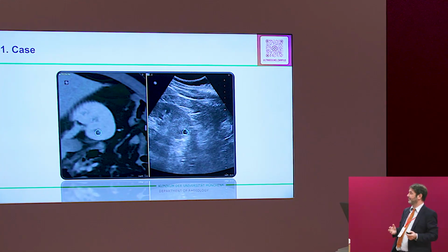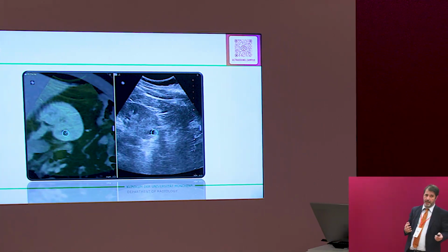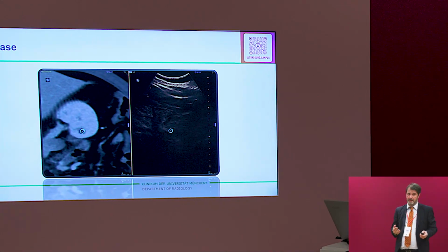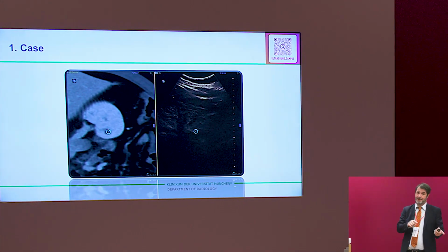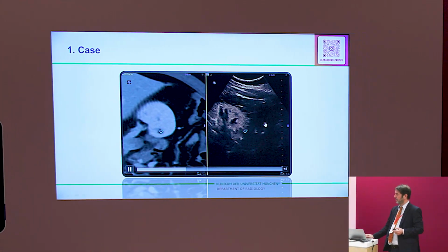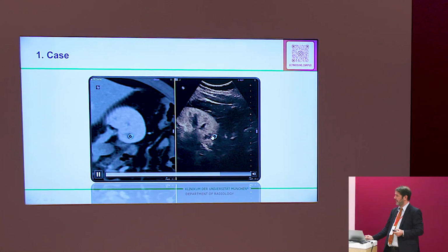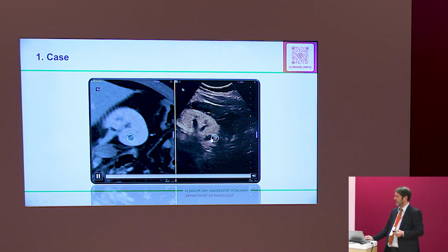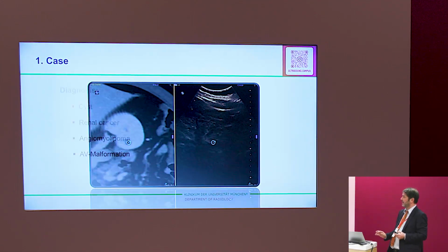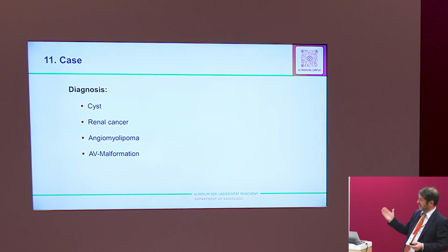And now we have to prove whether it's really liquid or something else. If it is liquid, no uptake, because there is no blood supply. You see, there is a lesion. Is it still black inside, just adjacent to the structure? Yes. Okay. This means we can make the diagnosis very fast.